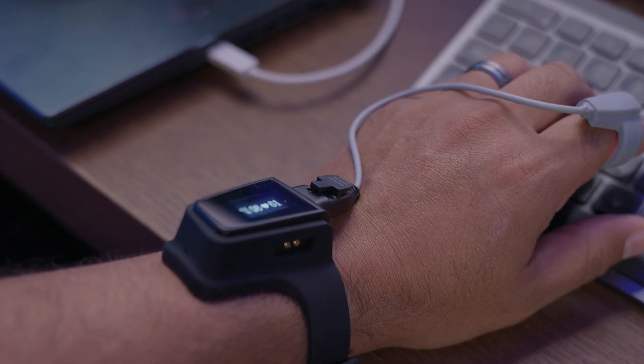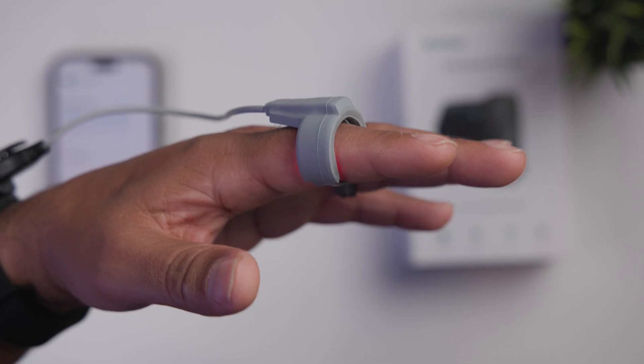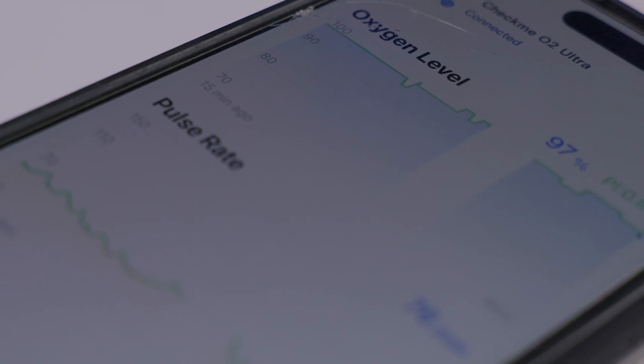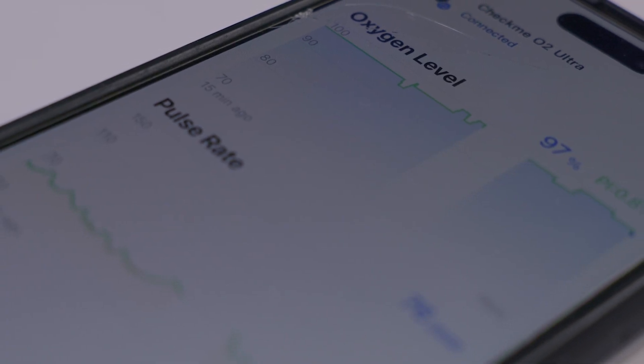The CheckMe O2 Ultra features continuous detection, extremely high accuracy, and fast, soft wearing and app synchronization, so you can see all of that on your smart device at the same time.